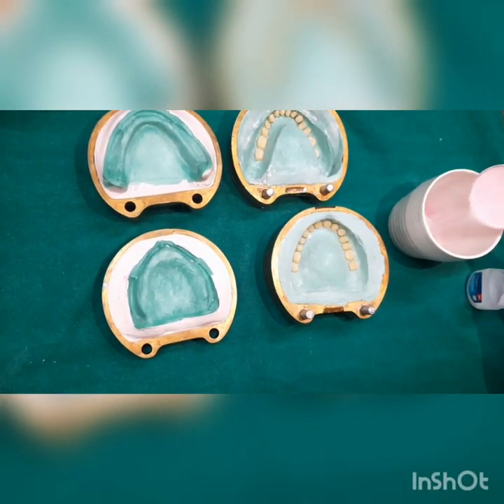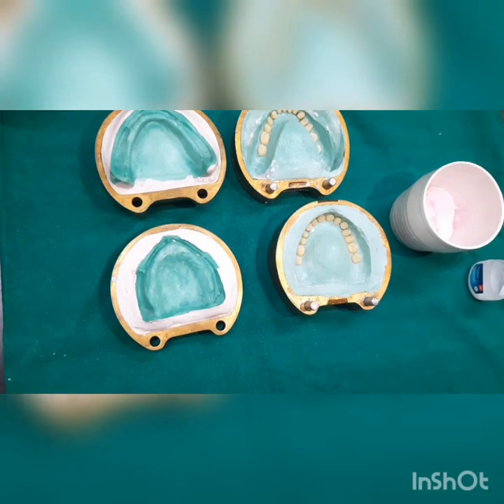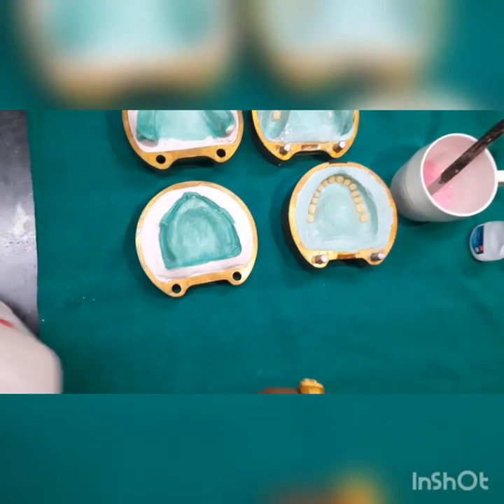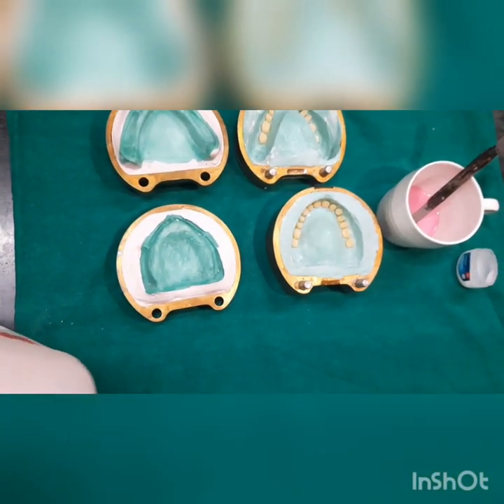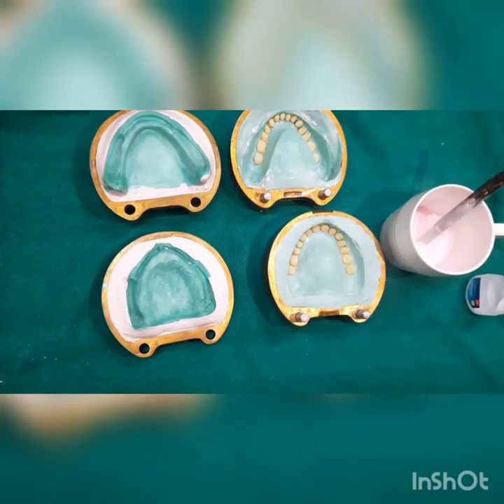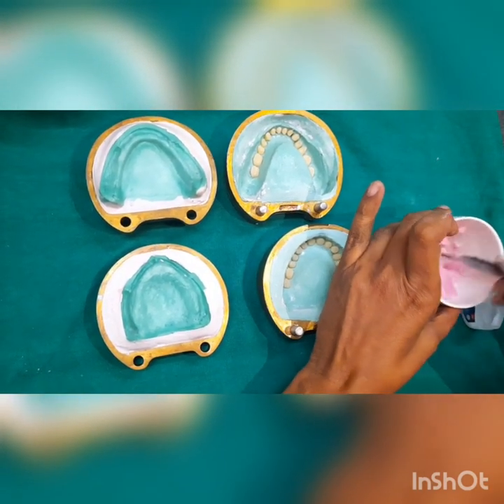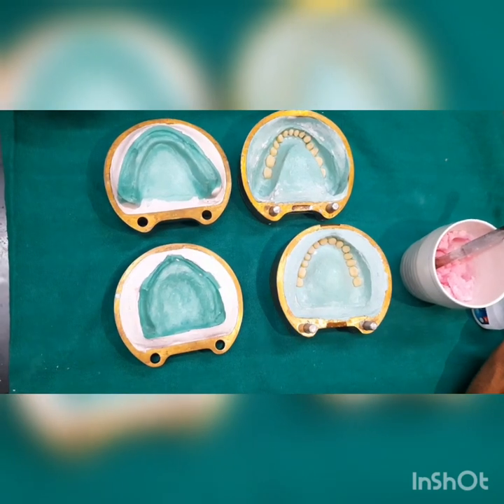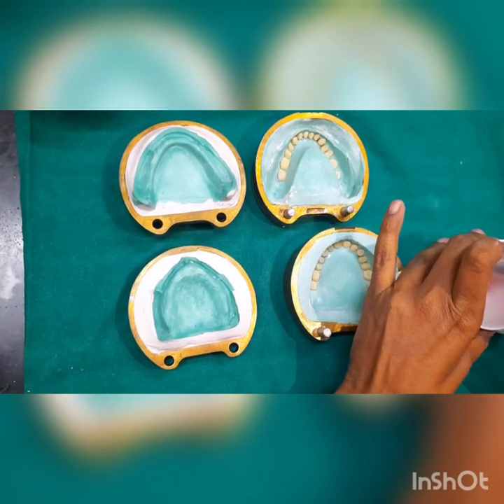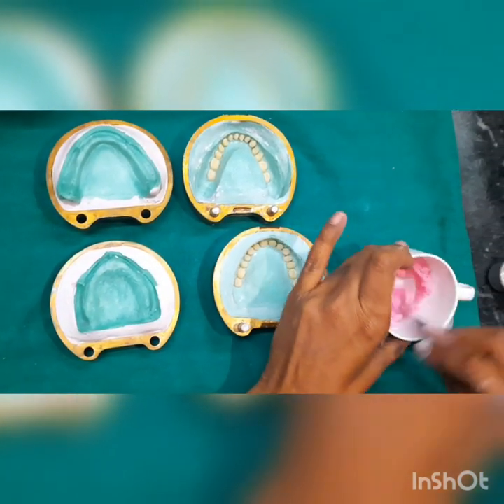Sift the polymer into the monomer like this. We are going to add a little more polymer. If you feel there is less monomer, you can always add more, because the mix should have a proper polymer-to-monomer ratio.